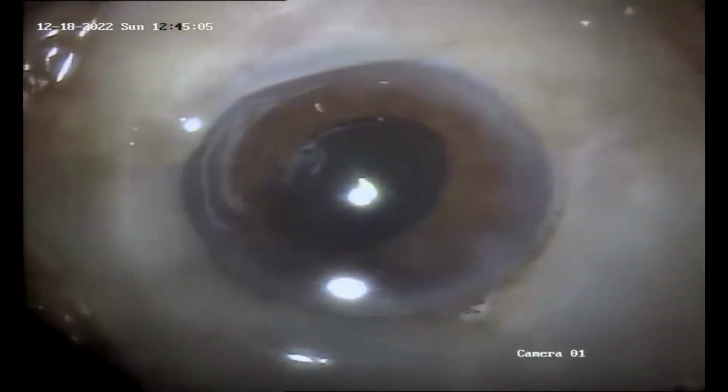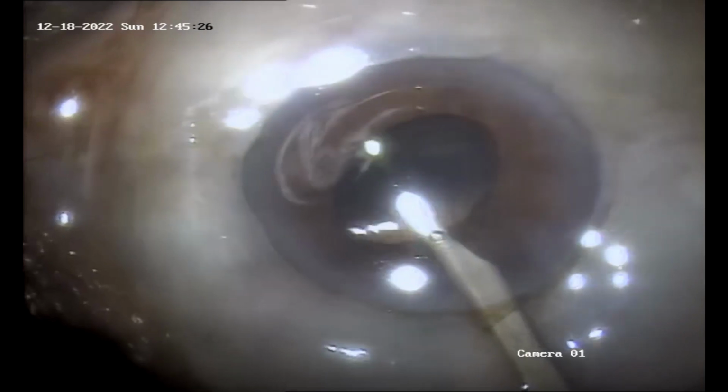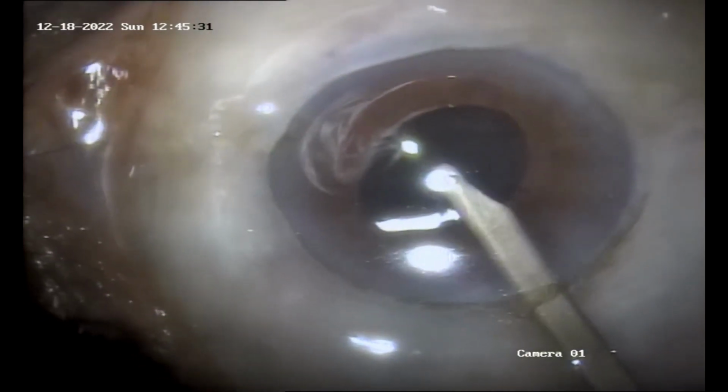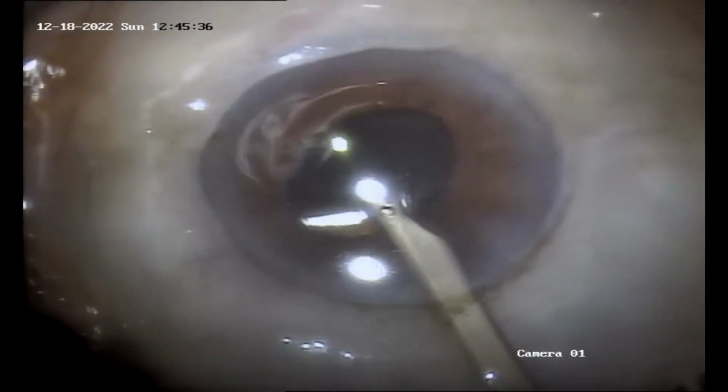And now I will remove the viscoelastic solution from the anterior surface of the lens, going a bit behind the optical zone of the lens.